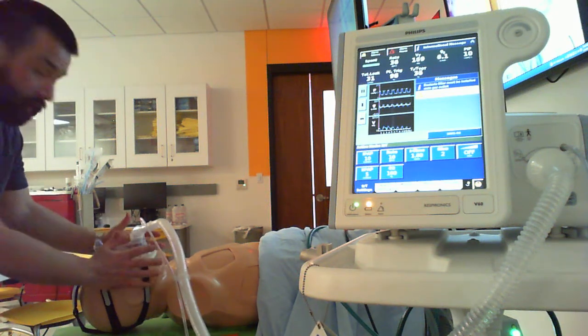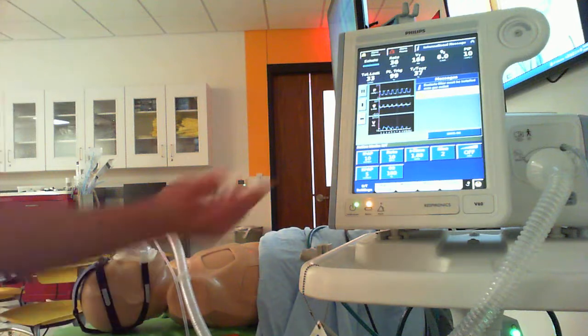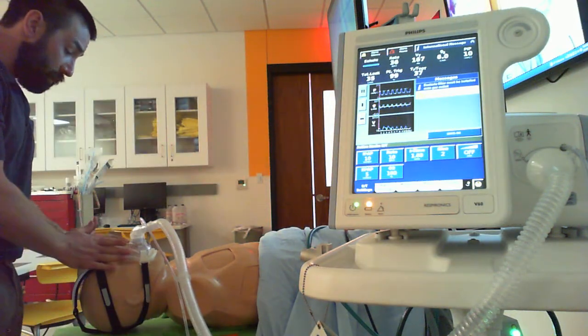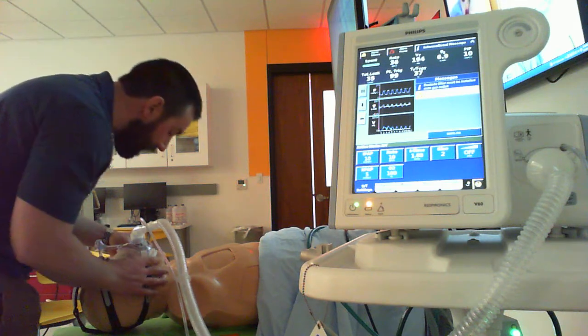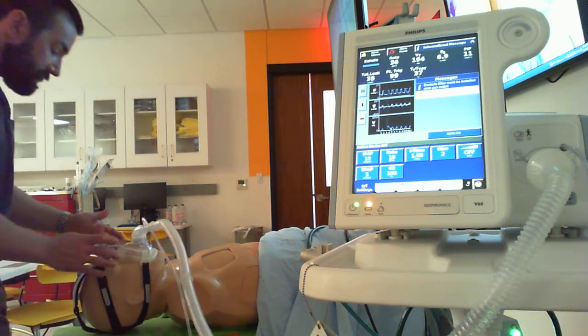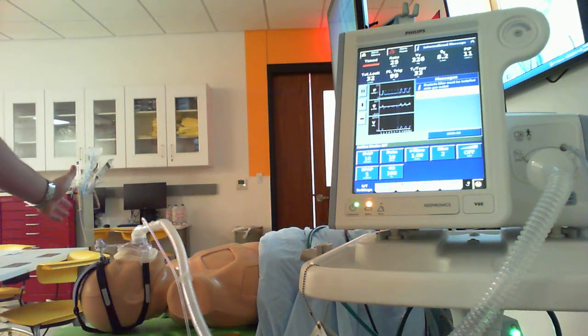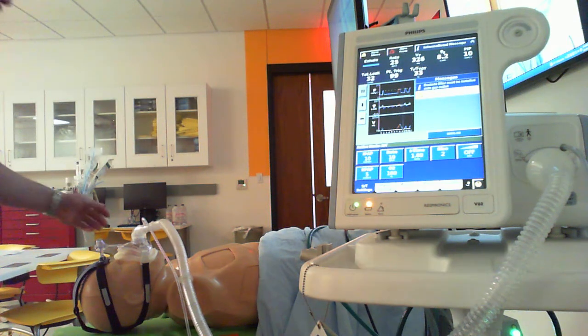And then I'm looking, listening, and feeling for leaks. I look up here, I got a total leak of 33, okay? I still want to make sure it's not spraying him in the eyes or anything like that. It looks like a pretty good seal on him, all right? Not having any excessive leaking. I can't feel anything spraying him in the eyes or anything like that.